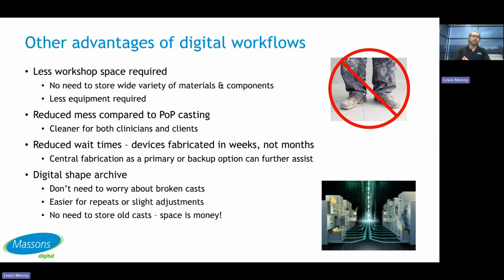I would imagine nearly everybody watching has broken a cast and knows the shattering feeling that makes you have inside, because you have to start all over again. With a digital workflow, especially beginning with a scan, if something goes wrong, you've got the shape on file, you can start again. That doesn't just make it easier in case something goes wrong, it's easier for repeats or slight adjustments. You don't necessarily need to store an old cast to fabricate a new device or fill something full of alginate. We can reuse the digital shape archive. It can also be really good for comparing before and after because we have this digital record.